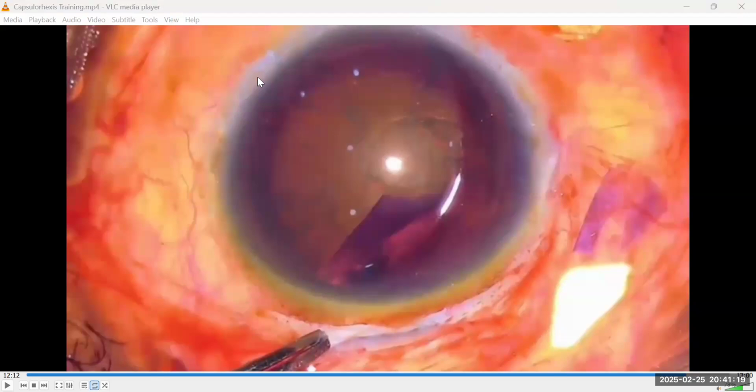And centripetal means what? To the center. It's the law of physics now, to the center. So this is what clock hour approximately? Remember, the surgeon's position is considered 12 o'clock position. I started with the side port, so the side port has automatically become the surgical 12 o'clock until I take it back to my main incision. So this is 12 o'clock position. I'm probably around 4 o'clock position, and because it's an awkward position for me, I have to pick it up and go centripetal. Across 4 o'clock is 10 o'clock, so my angle of motion will be towards 10 o'clock position.